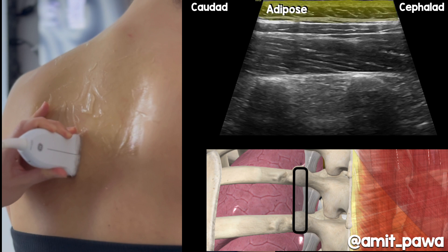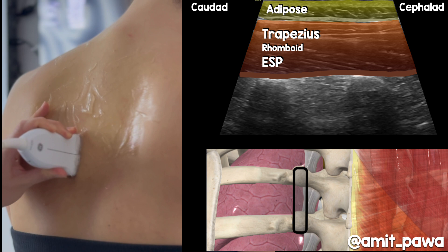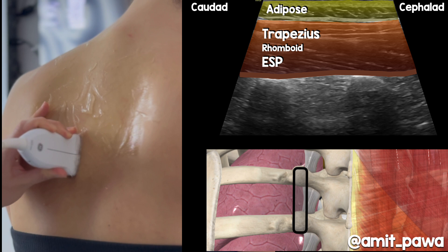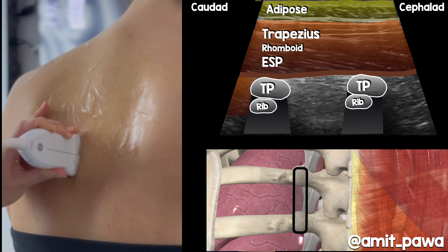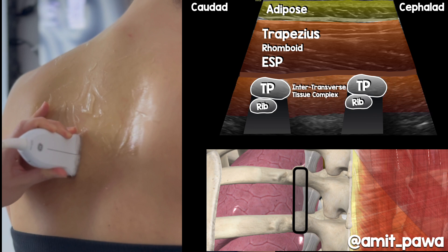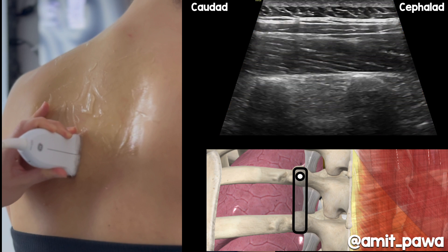Let's add some highlights. Here's the adipose, here's the trapezius and what would have been the rhomboid muscle — in small letters because we're scanning just below where the rhomboid has ended — and then we've got that large erector spinae muscle bulk. We've then got the transverse process shadow overlying the rib, then the intertransverse tissue complex, and deep to all of that you've got the pleura. That's your initial view.